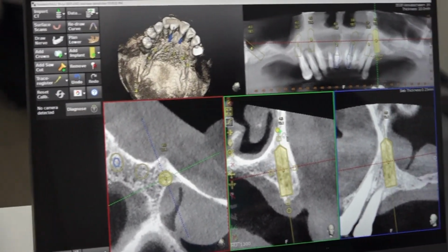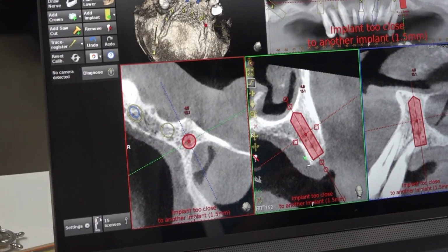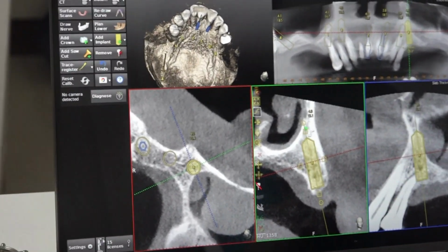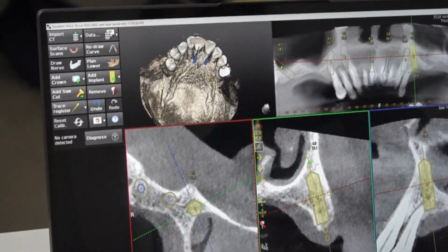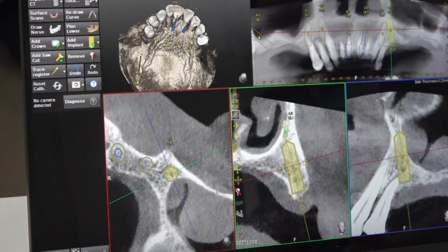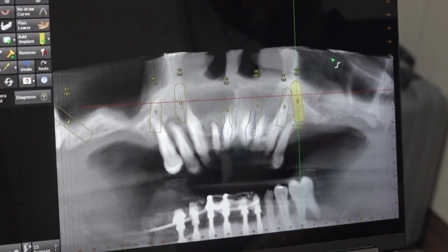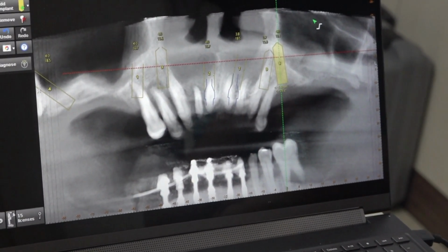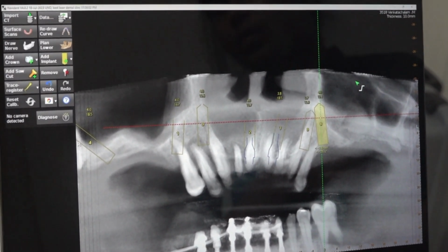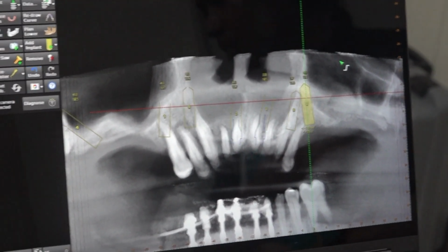See, if we tilt this implant palatally, then it shows close, right? So this is one trick we should know: tilting buccally and lingually to get a good inter-implant distance. Okay, so the left side is a little more challenging than the right side. The challenge we get on the left side is that we have to give the exact mesial tilt. If we don't give the tilt, we may enter the sinus.